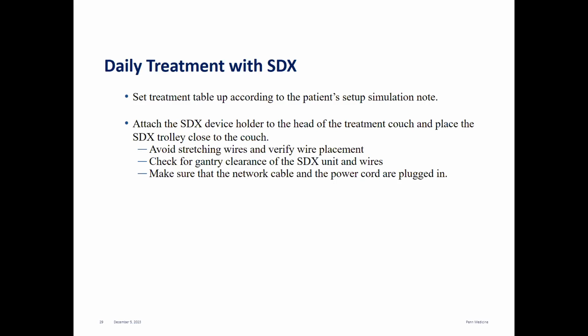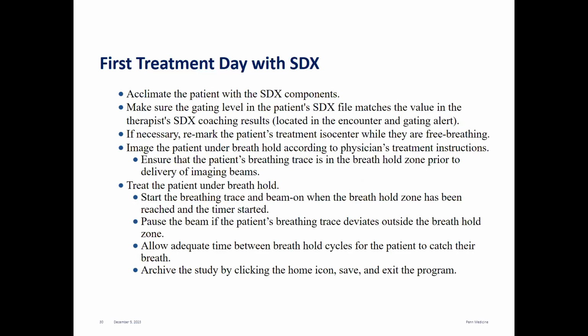And you, of course, want to do a dry run with the patient before you leave the room. So like I said before, you want to acclimate the patient with the SDX components. Like show them the mouthpiece and how to put it in again, and run through a few breath hold cycles before leaving the room.